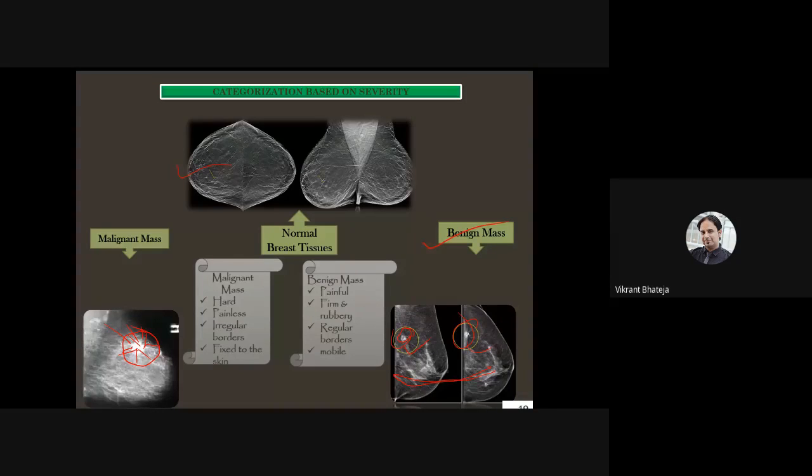And once the edges are clearly visible, a radiologist can manually see those edges and predict the nature of the malignancy. If you are going for an automated CAD diagnosis, a machine learning approach, then from these edges and structures, shape, edge or texture features can be extracted. They could later be fused, or optimized and further selected to reduce the redundancy, and then given to the classifier. So this is how the severity analysis can be ascertained from these images.